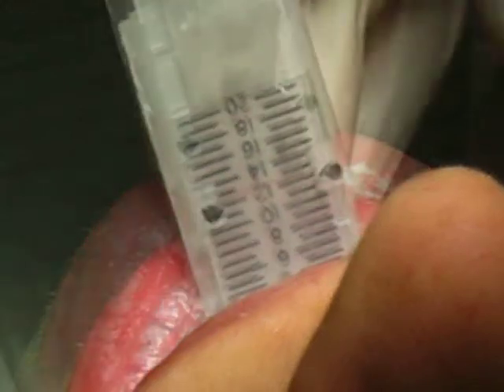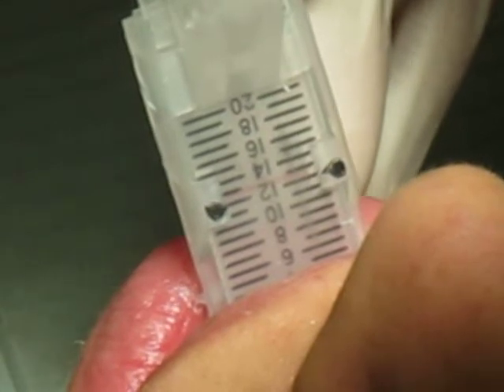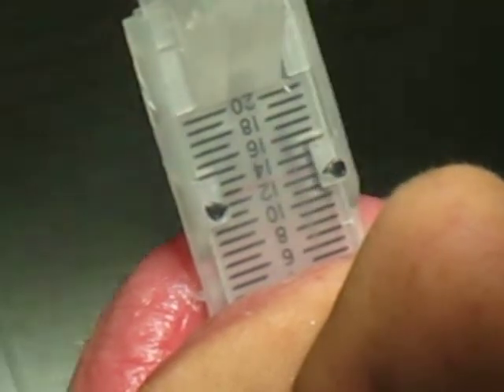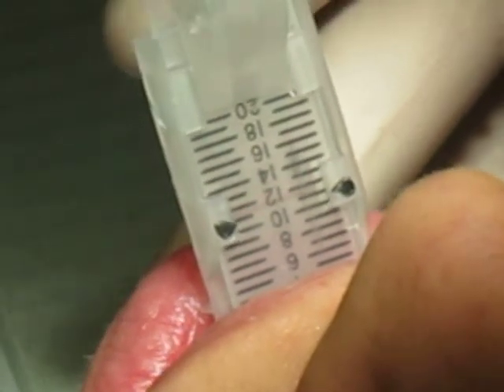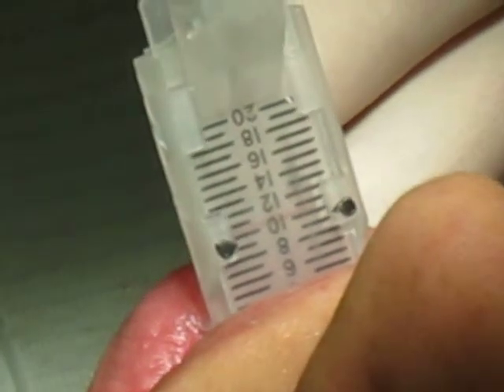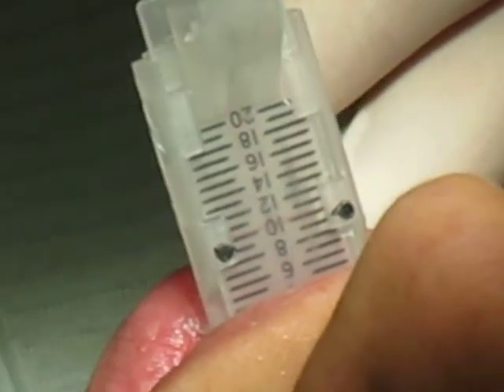The third and final scale reading is the patient's full retrusive position. Ask the patient to slowly move their lower jaw backward as far as possible. In this case, the patient's full retrusive position is 10.